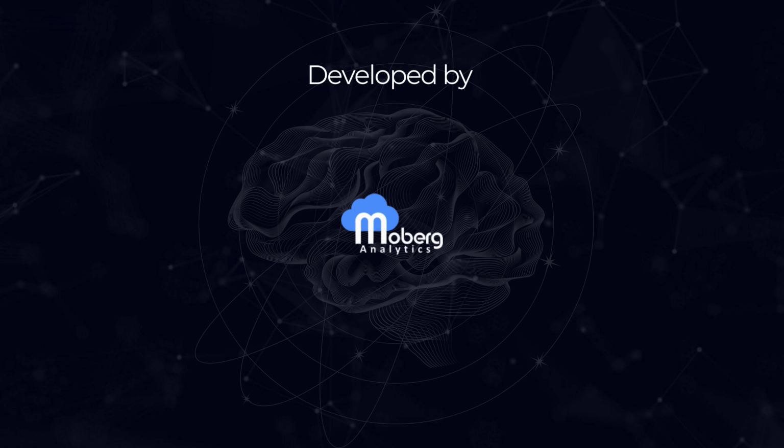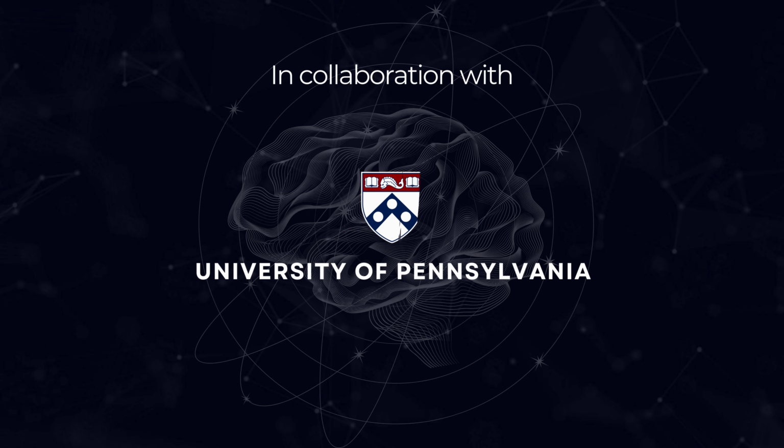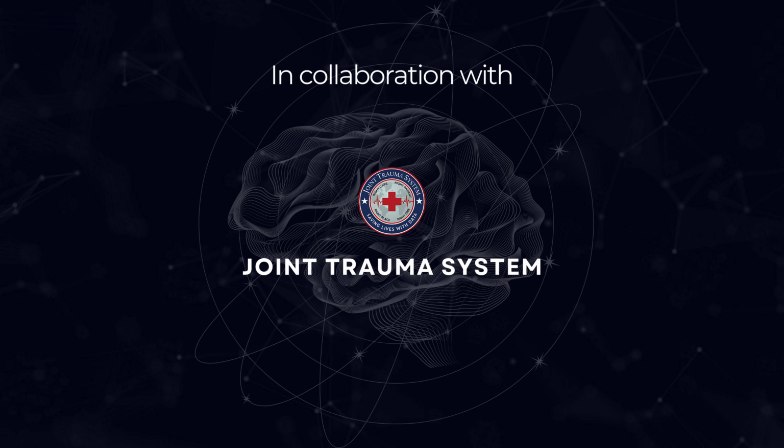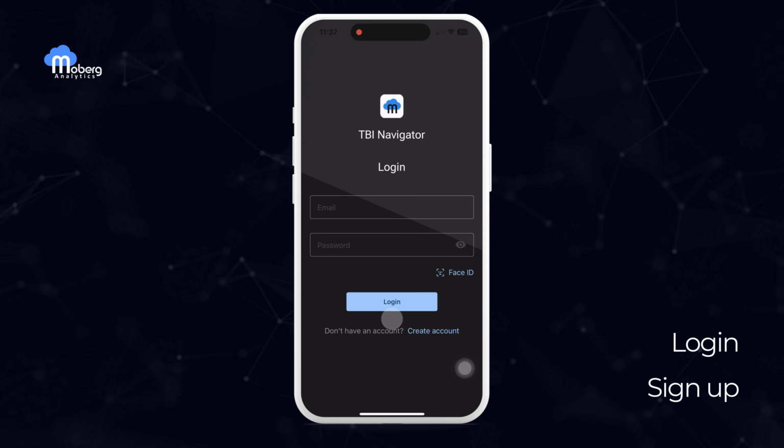The TBI Navigator is the result of a collaborative effort by our development team at Moberg Analytics, including Ragged Edge Solutions in Greenville, North Carolina, the University of Pennsylvania in Philadelphia, the Joint Trauma System, and the Traumatic Brain Injury Center of Excellence. Now, let's dive in and explore the features and functionality of the app.